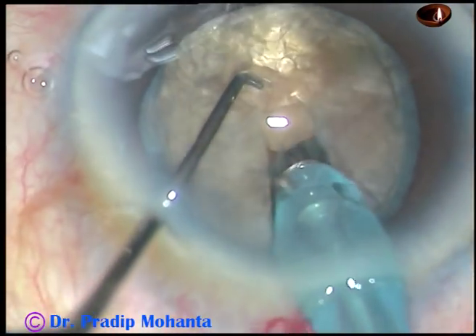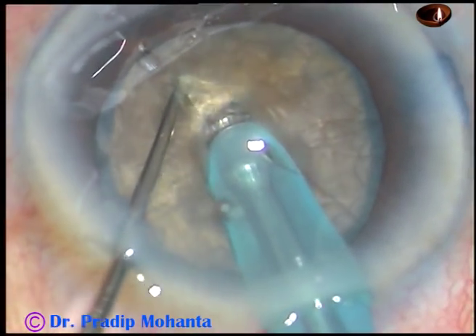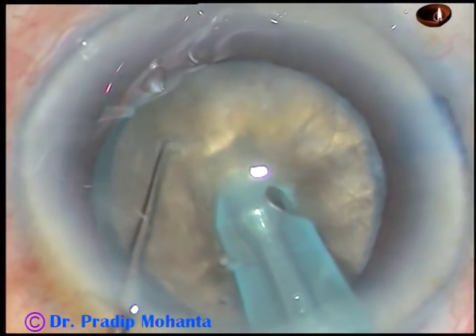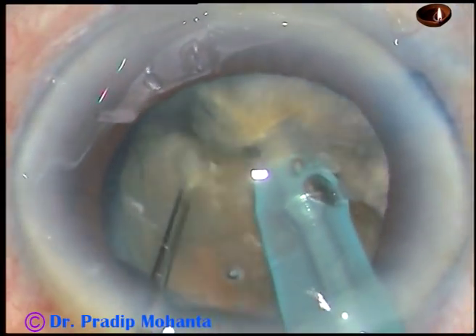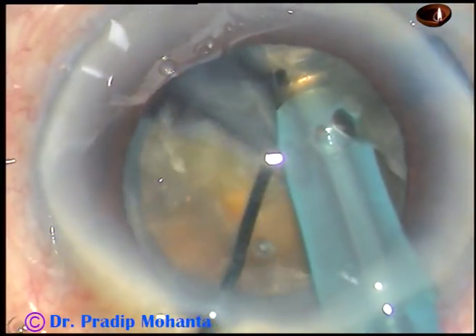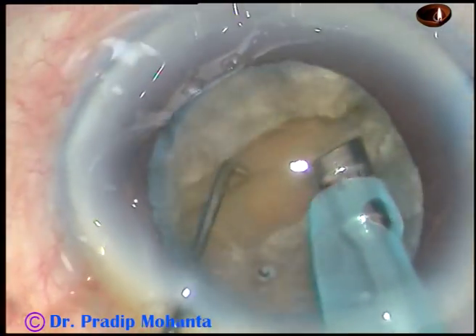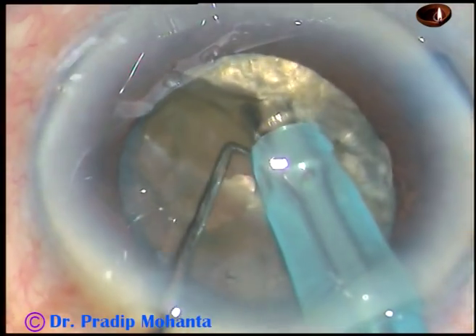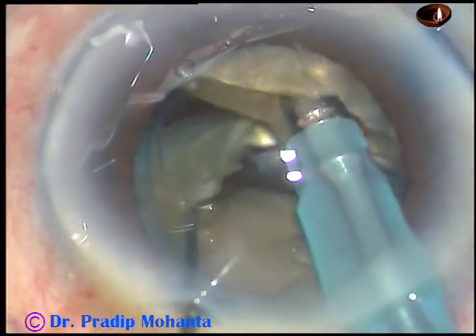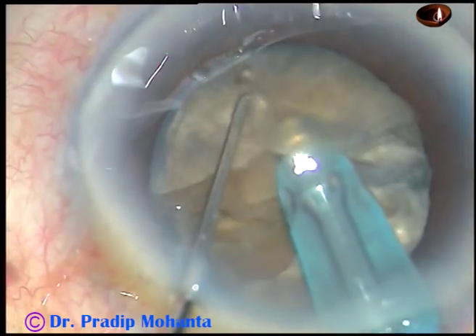Here is my stop-and-chop technique. I go through the substance of the nucleus for some distance, almost near the opposite equator, support the nucleus with the chopper, and then chop it like this. This is a very good crack. Rotate the nucleus 180 degrees and try to separate the nucleus into two halves. There is a leathery band but it will not cause much problem.